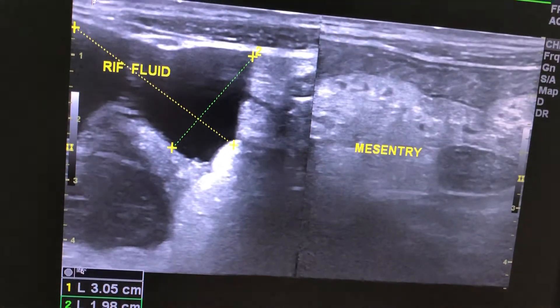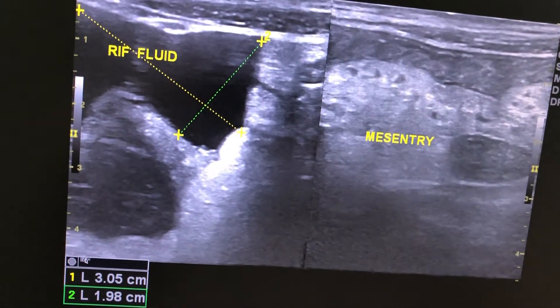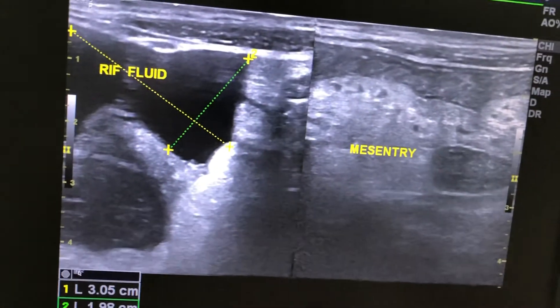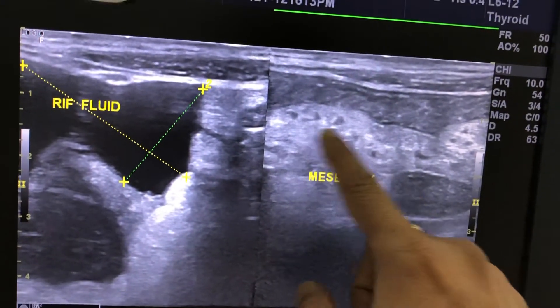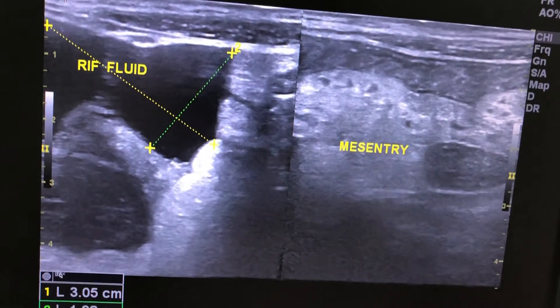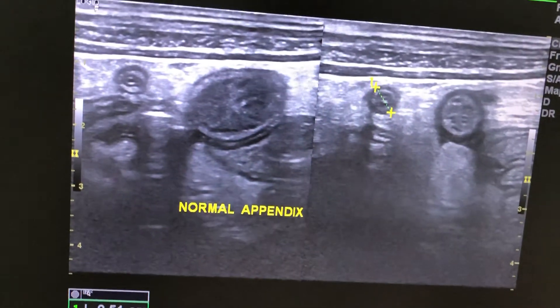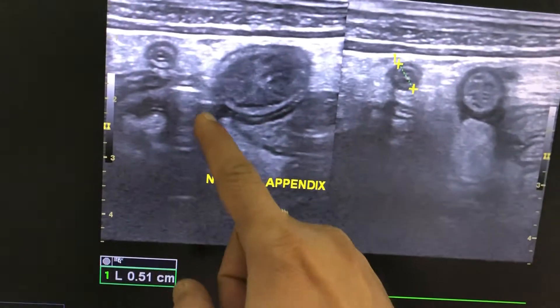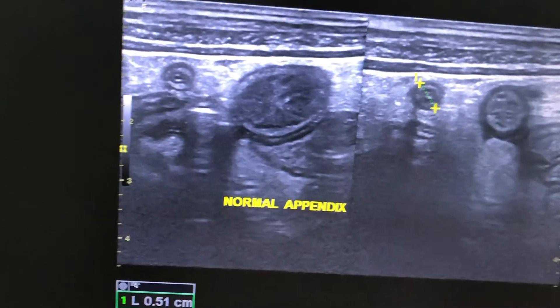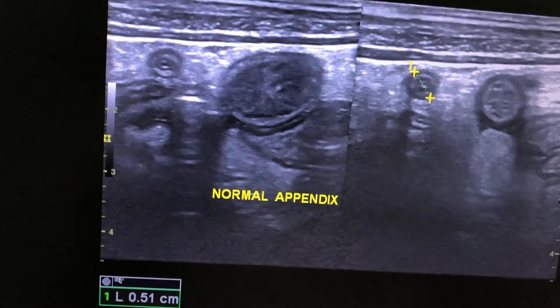There was fluid in the right iliac fossa with echogenic and edematous soft tissue fat. This was a normal appendix, and it is covered with echogenic soft tissue fat.